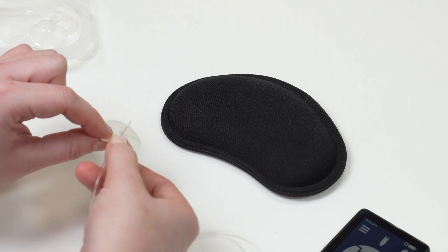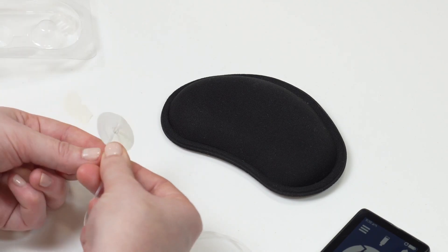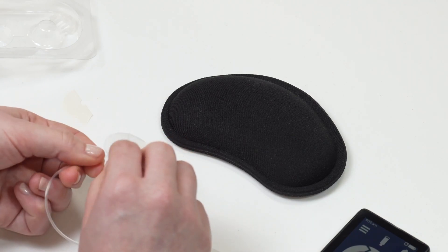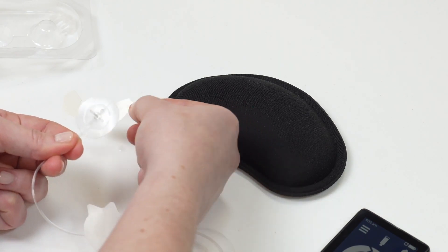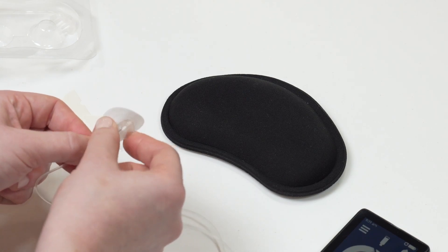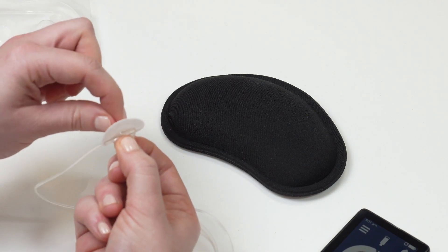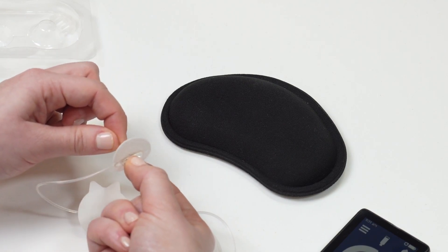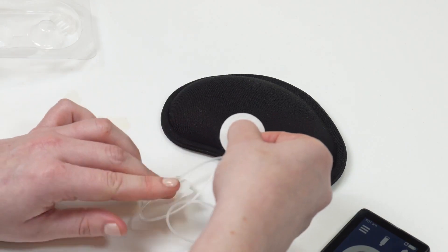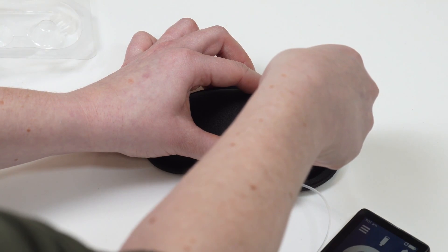To insert your infusion set, remove the adhesive backing from the infusion set. Pinch the plastic circle on the back of the infusion set to make a small handle. Gently twist the needle guard off of the needle. Pinch the skin and insert the infusion set at a 90 degree angle. Push gently on the center of the circle and rub the adhesive around the circle to help secure the infusion set.